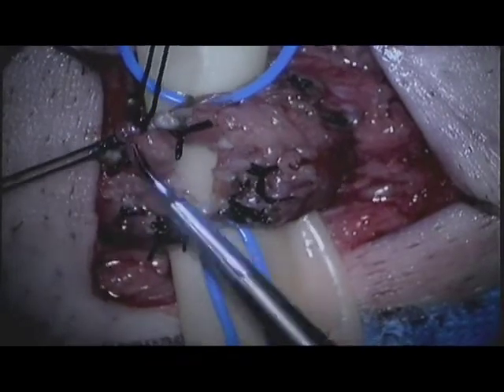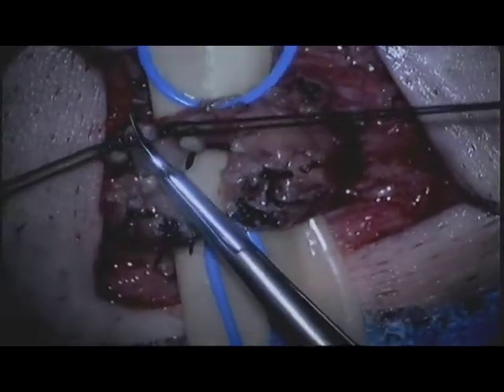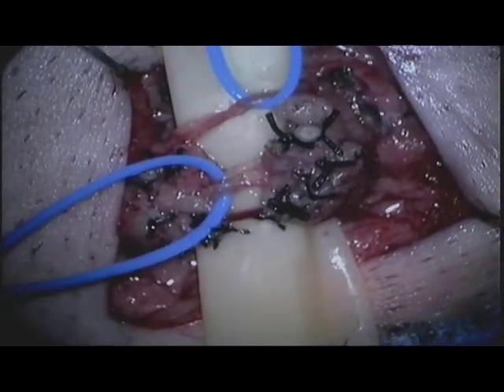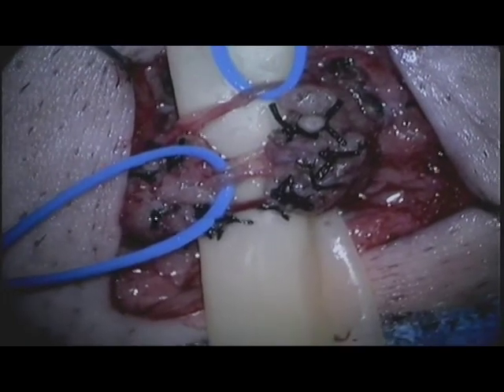Here is shown the final product of three preserved lymphatics and one preserved testicular artery, with all surrounding structures, including nervous tissue structures, being transected.